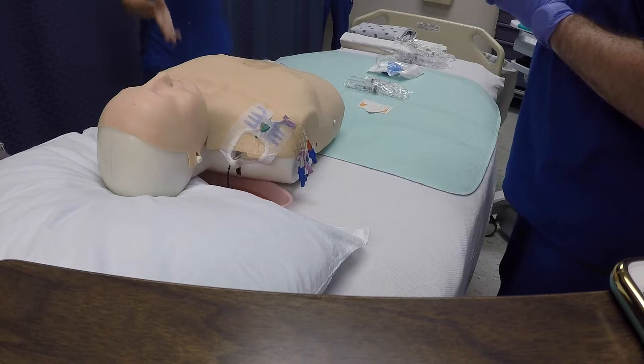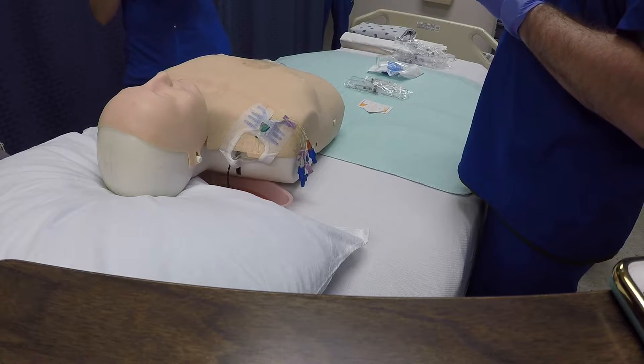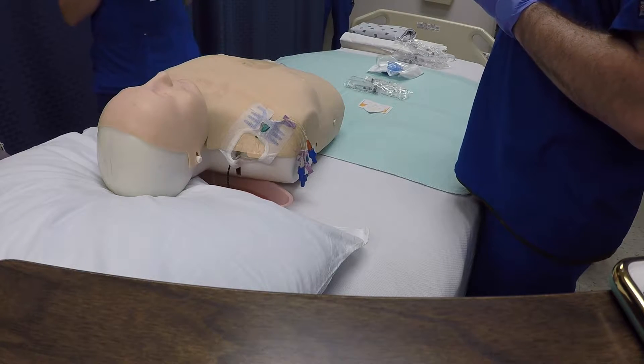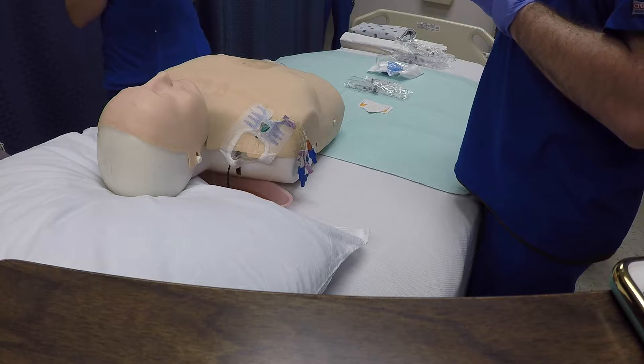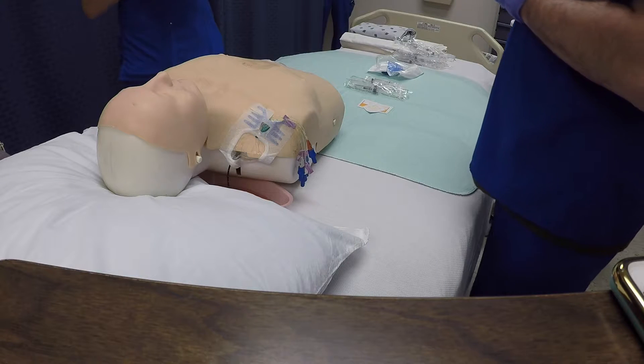All right Clay, so you've gone through it — you've done the important steps and the key points. Now we want you to do it one last time. I want you to tie all of them together and tell me the important steps, the key points, and the reasons for the key points.